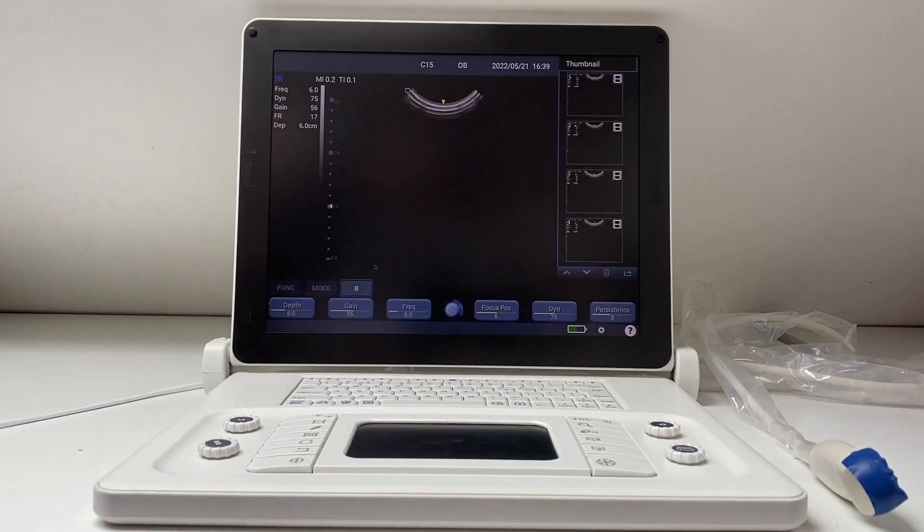There are three major differences between the new scan pad and previous versions. The first is the quality of the transducer. It now uses ScanX probe technology, which gives you a clearer, sharper image.